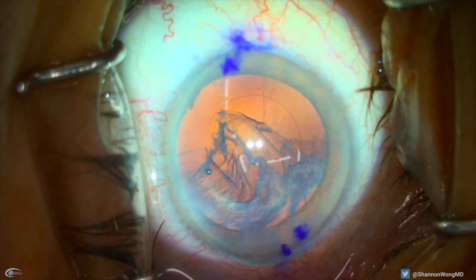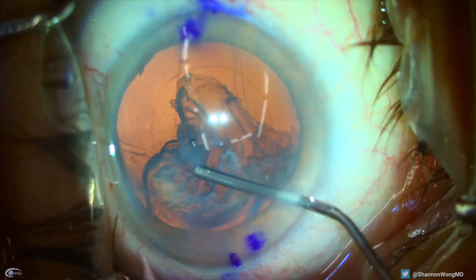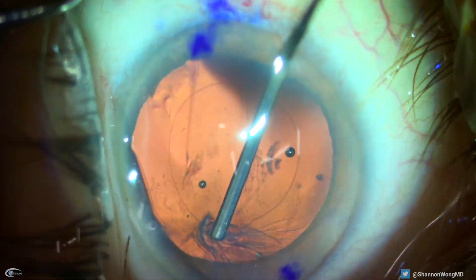We make multiple paracentesis incisions to allow us to access the cortex from the most advantageous angles. We are ultimately able to remove the cortex in its entirety and polish the posterior surface of the anterior capsule.